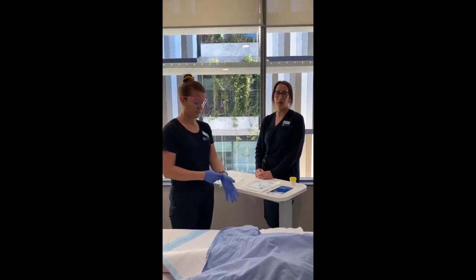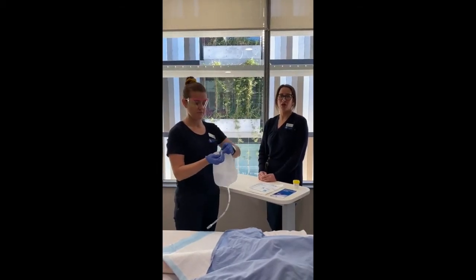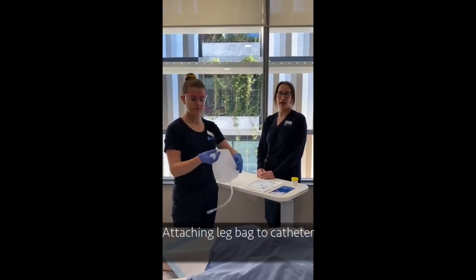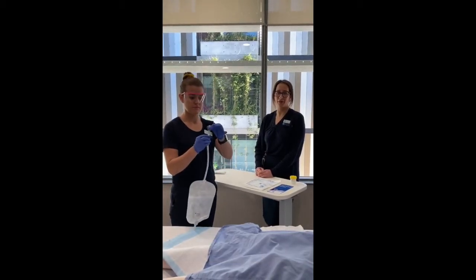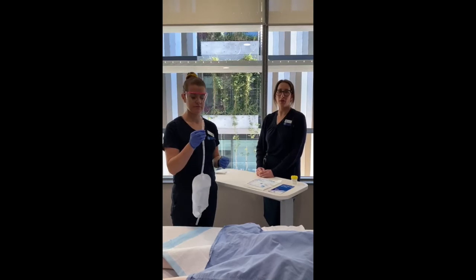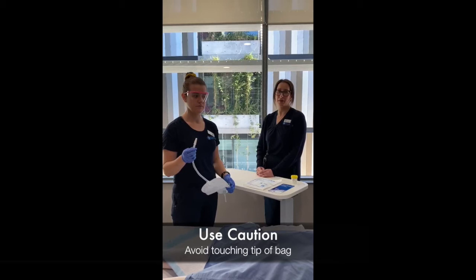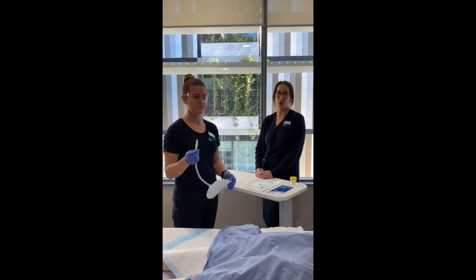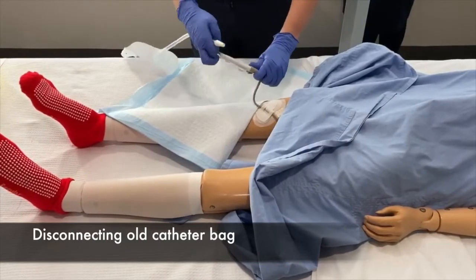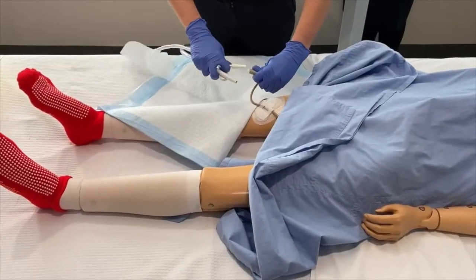A brand new leg bag needs to be shut before attaching to the catheter. To attach to the catheter, carefully remove the grey tip on the top of the catheter. Be careful and try your best not to touch the top of the new catheter below the grey cover, as this part will be connected into your catheter and we aim to keep it as clean as possible. Gently disconnect the catheter bag currently attached, then attach your new leg bag as shown.